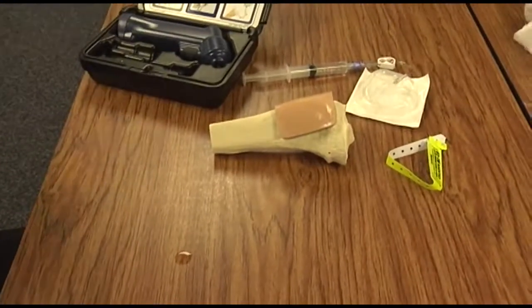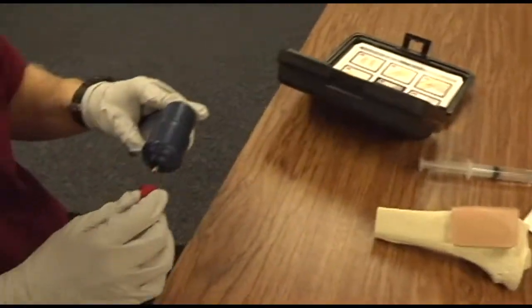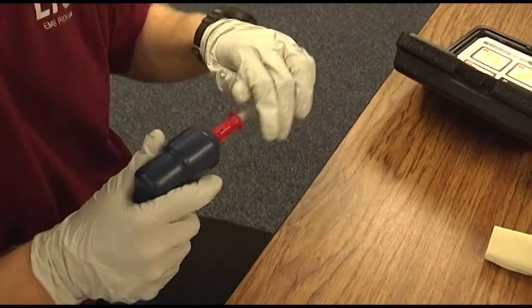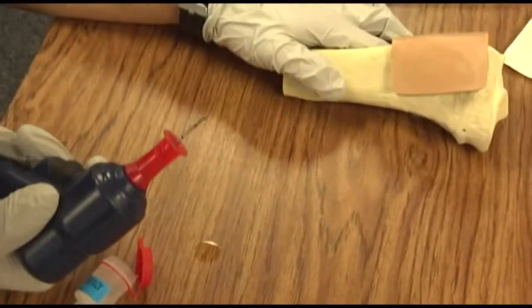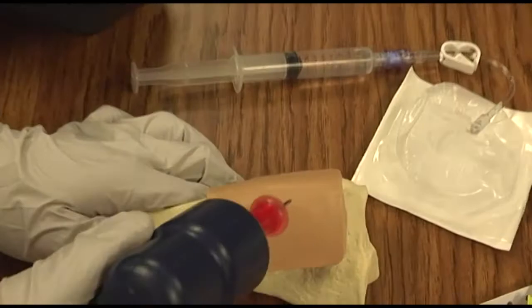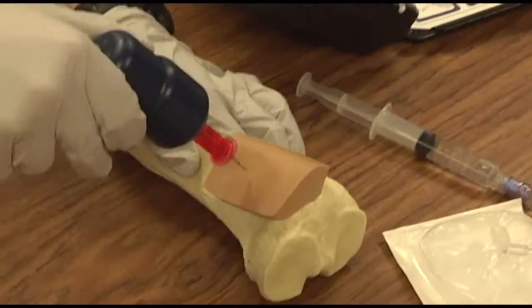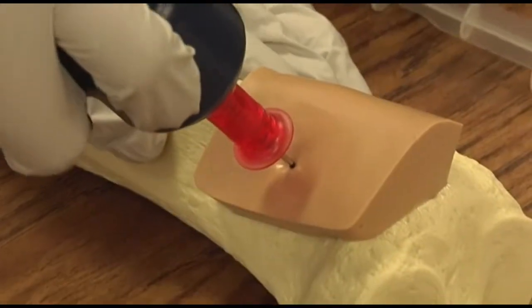Get your drill ready. It's selected the adult needle. Attaches the needle to the drill. Inserts the EZIO needle at a 90-degree angle, pushes it through the skin first without drilling, and ensures that the 5mm mark is visible.